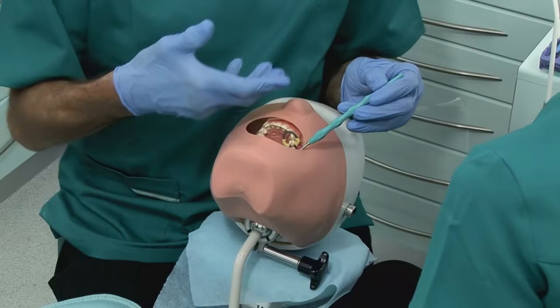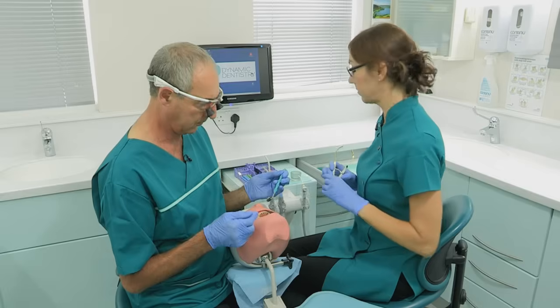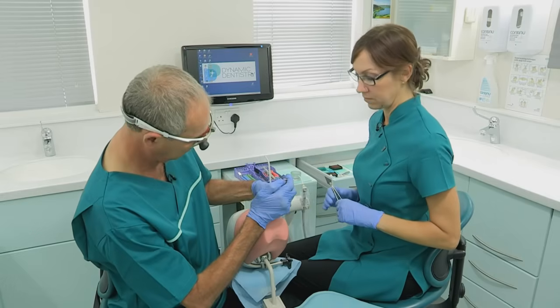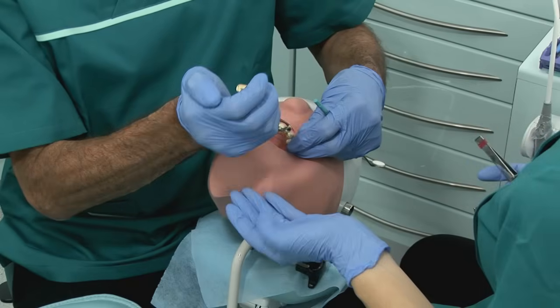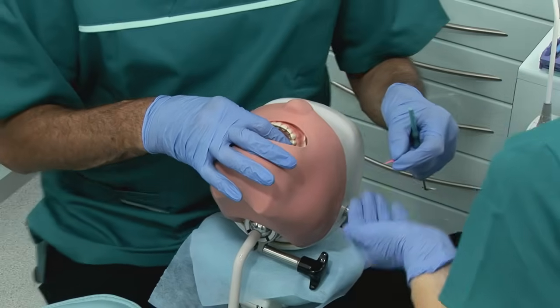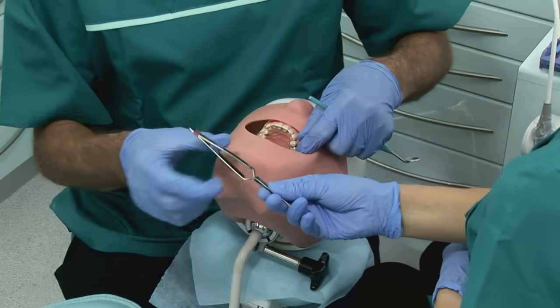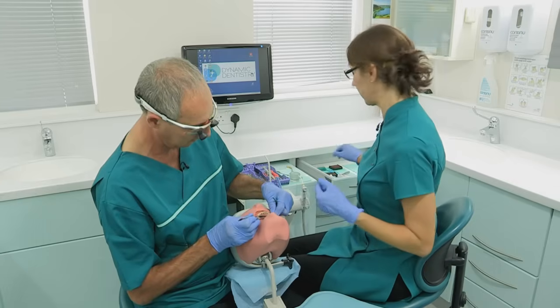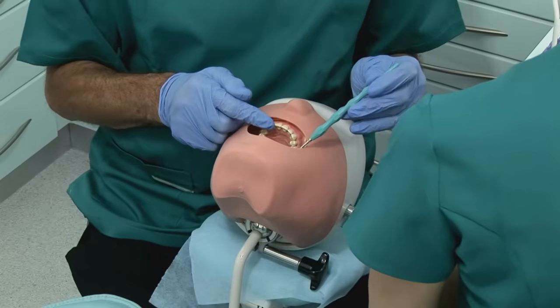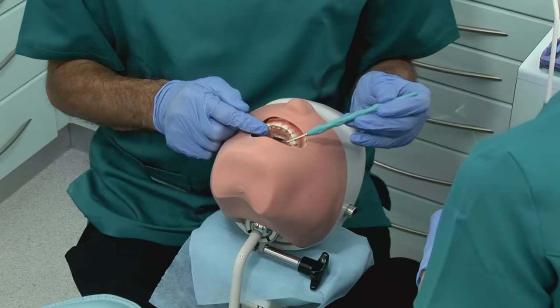Having done all of that, we now need to get rid of all this stuff that's in the mouth. So we want to take the band off, and it goes to the nurse's side. We then take the wedge out. Gets boring, it goes to the nurse's side. We take the band off, and it goes to the nurse's side. Now we can just finish it off in any way you want to do it.